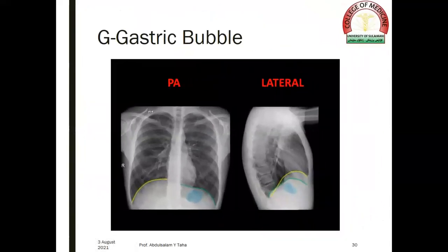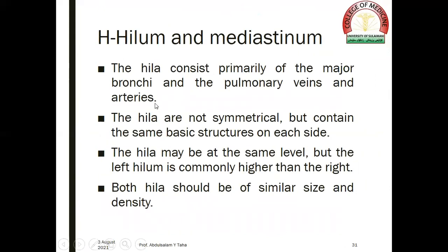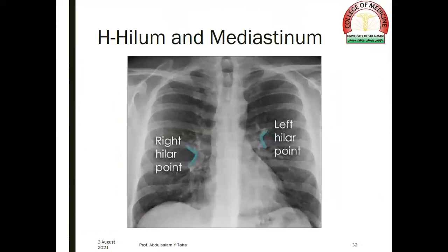The gastric bubble is seen underneath the left hemidiaphragm in the PA and lateral view. Hilum and mediastinum: the hilum consists primarily of the major bronchi and the pulmonary veins and arteries. The hila are not symmetrical but contain the same basic structures on each side. The hila may be at the same level, but the left hilum is commonly higher than the right. Both hila should be of similar size and density. The left hilum is higher than the right.